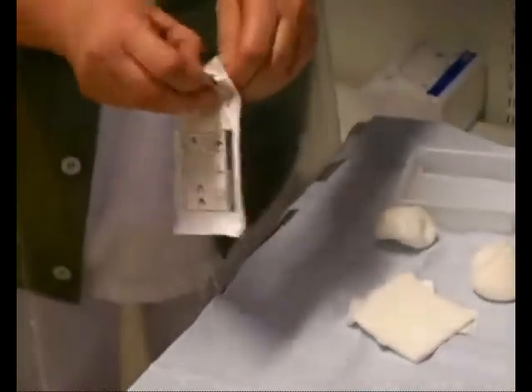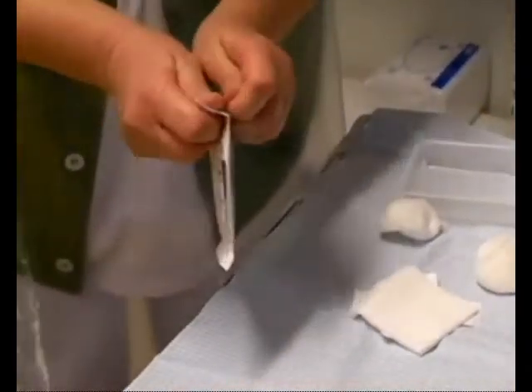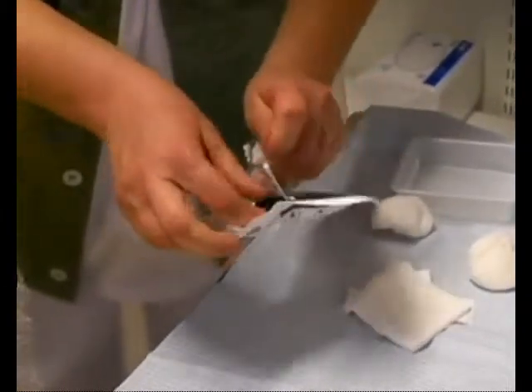Remove the sensor patch from its pack. The sensor patch must be labelled RedSense. Ensure that the sensor patch is not mechanically damaged and that the fibre is inside the patch.